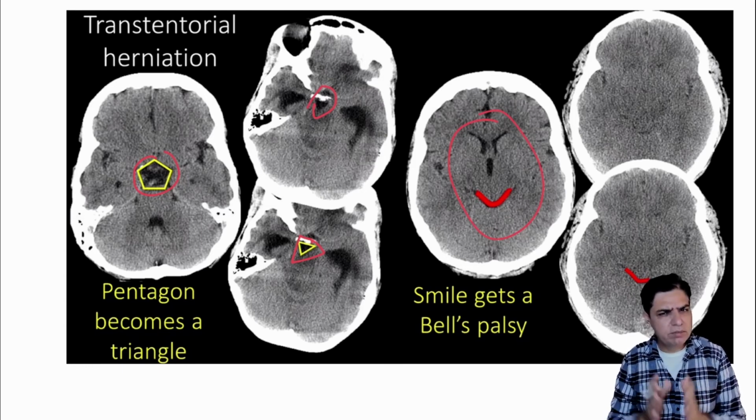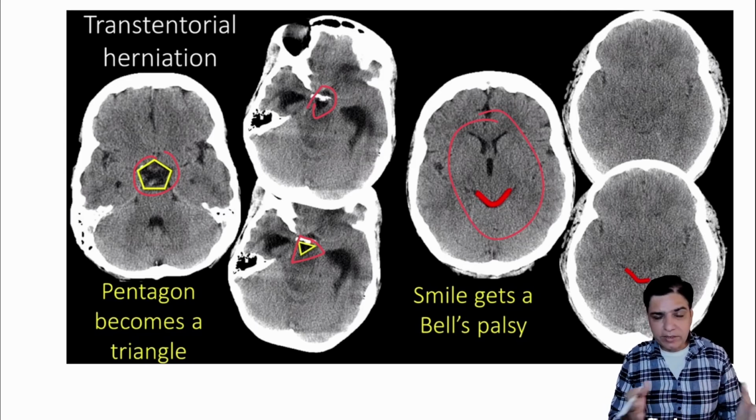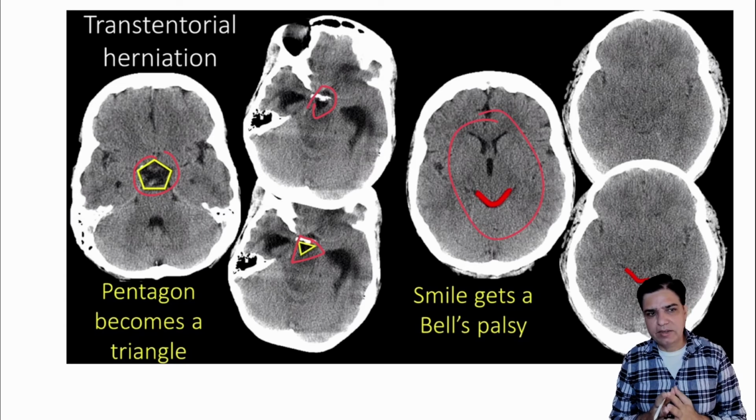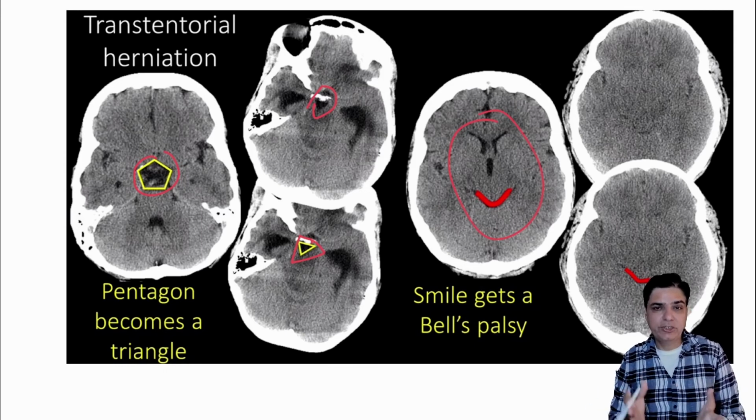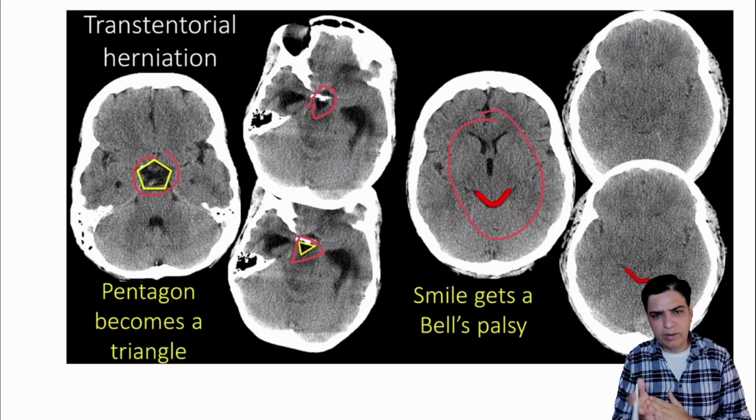Nevertheless, CT brain is always a very good starting investigation when you are suspecting bleeds and strokes. So remember, in adult medicine, stroke and infarctions, and bleeds because of aneurysms or high blood pressure, are quite common. In children, they can get stroke because of different types of pathologies, especially if they've got coagulation disorders, or anatomical vascular problems, or tumors.